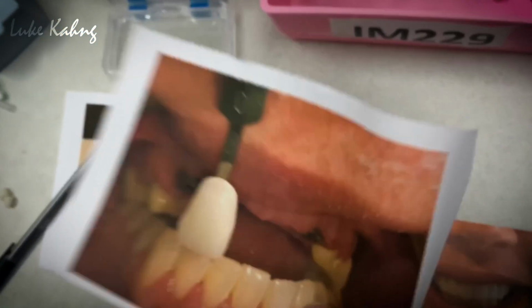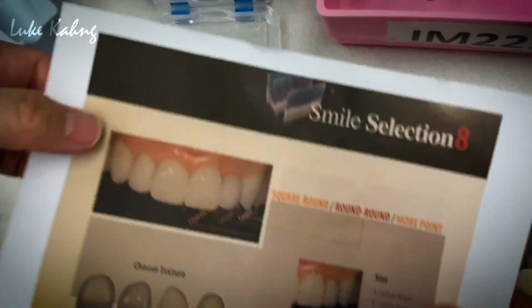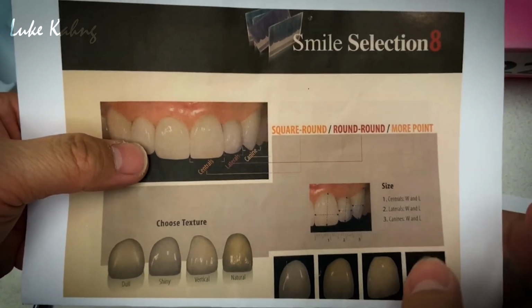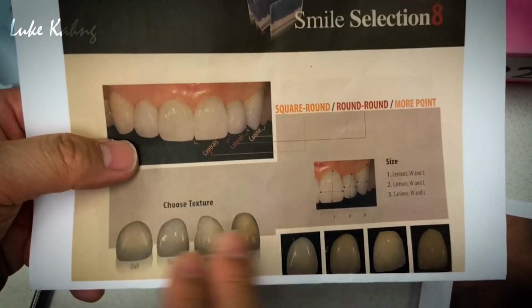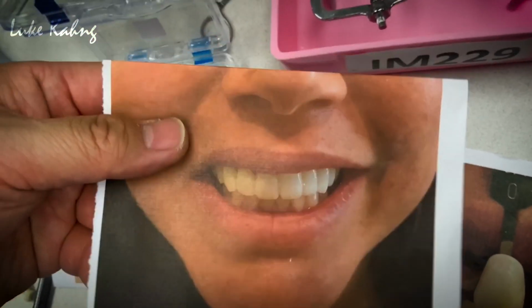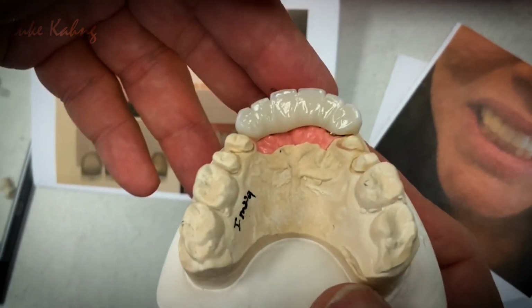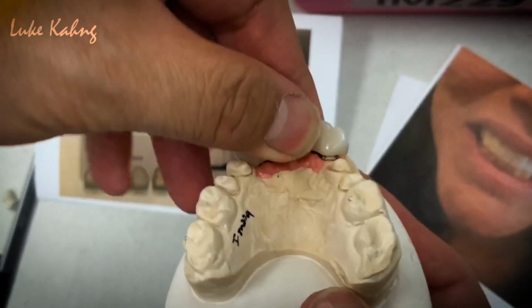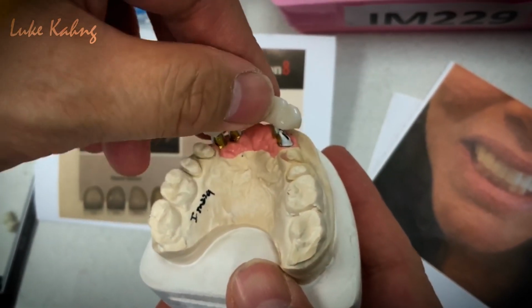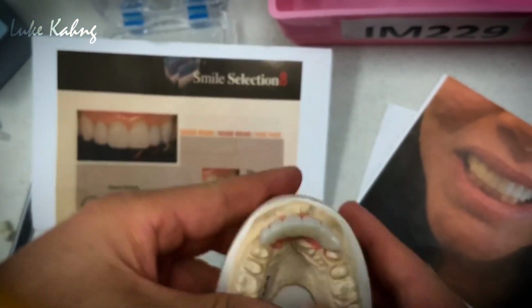Now, here is the tooth prep, and this is our book, which Dr. I made a long time ago, 15 years ago. Scale, round tips, shade tab, everything. The doctor gave us the temporizations. That's one, and then this one is all zirconia, and then we finalize it with the highest aesthetics, side by side here.